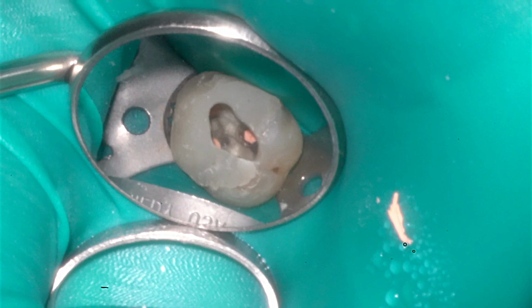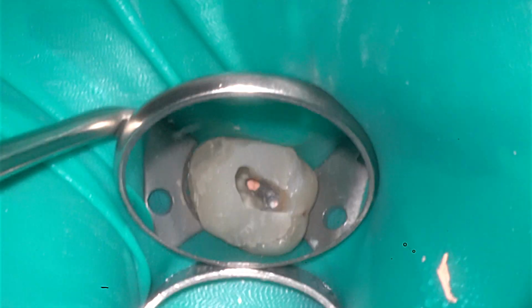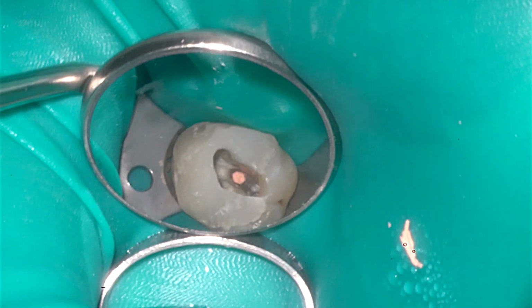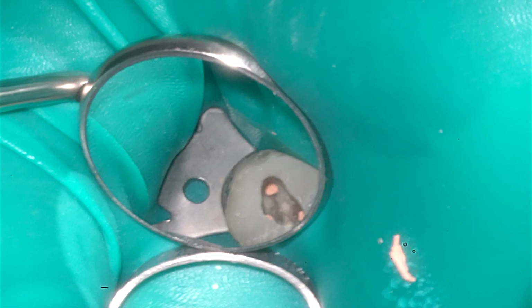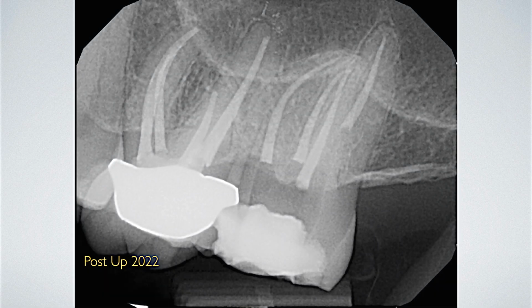And we continue so that here at the end we have done our hydraulic condensation, and we have our 4 canals obturated using the same technique that 12 years ago I did on the tooth in front of it for him, to have isolated and localized these canals, and have used now the EndoSequence BC Sealer protocol in this particular case. And you can see in the post-op radiograph, we have immediate post-op on the tooth, that we have found all 4 canals and instrumented them.